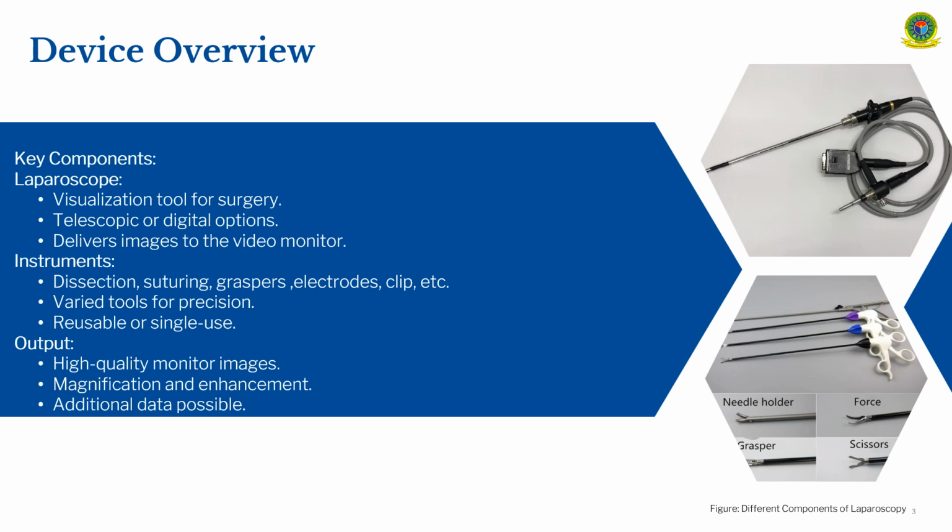Now, what are the outputs? It actually gives high quality monitor images, and there is other data that can be extracted from this.